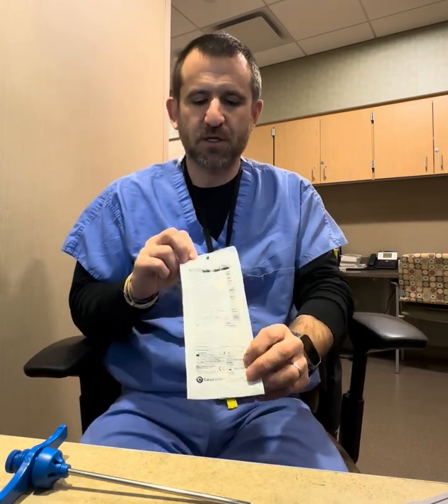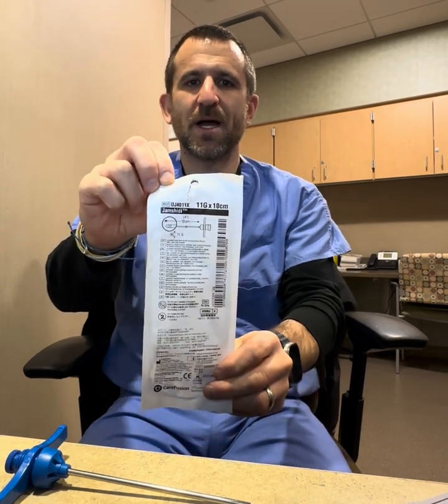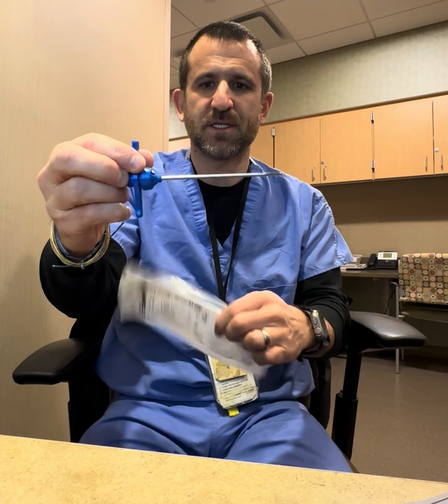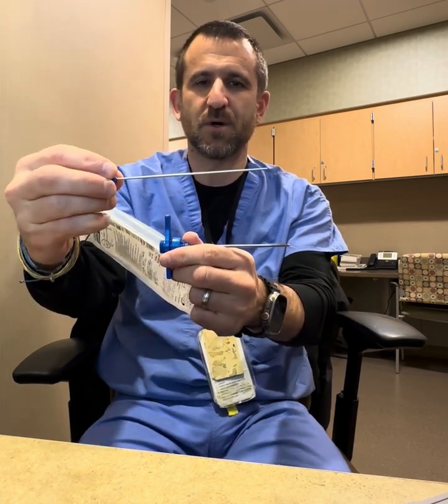Hey everyone, quick demonstration of a procedure we did here in clinic. We used a device called a Jamshidi needle, which is a bone culture or bone biopsy needle that can be used to harvest bone. What comes in this package is the Jamshidi needle itself, and down the center of the needle is a stylus, which we're going to show you what we use that for.